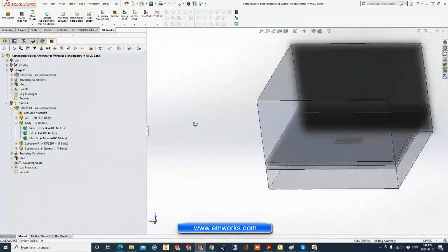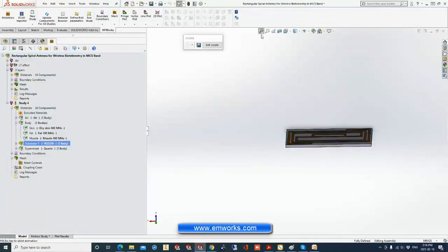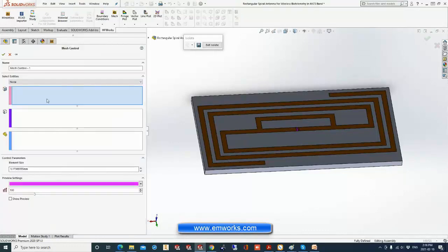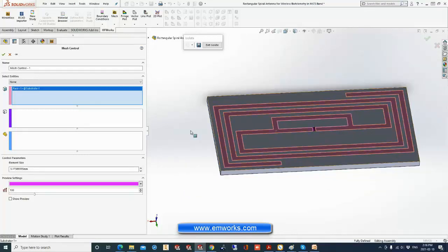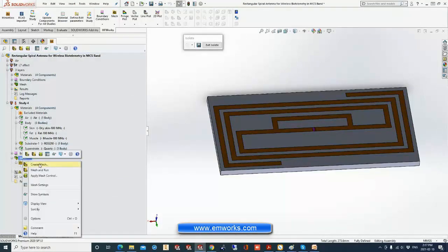Now, the last step is to create the mesh. The mesh process is very easy. Let me isolate the substrate again. Here you go to mesh settings, and you can adjust the parameters from here. Also, it is possible to apply mesh control. If you have some expertise with RF devices, you know that the maximum field is on the outer edges of the traces. So for this reason, you can select the trace faces, extract all edges related to this face, and assign a very fine mesh, just to make sure that the software catches everything and the results will be accurate.